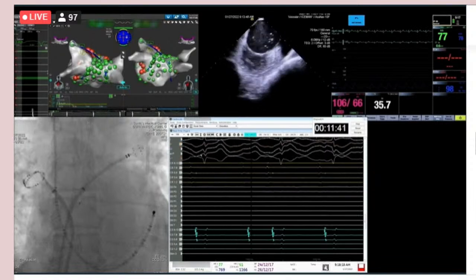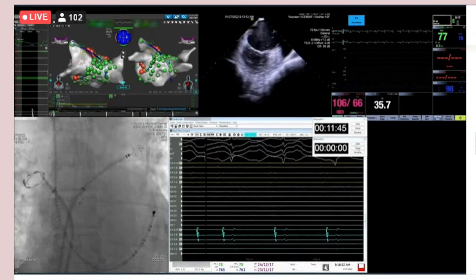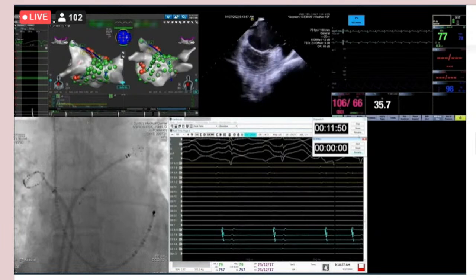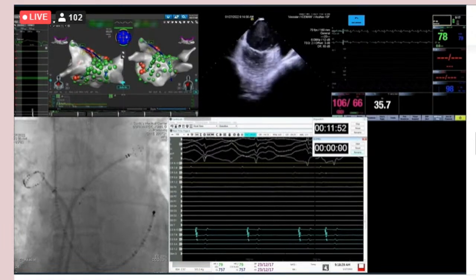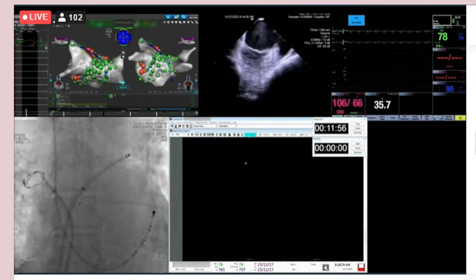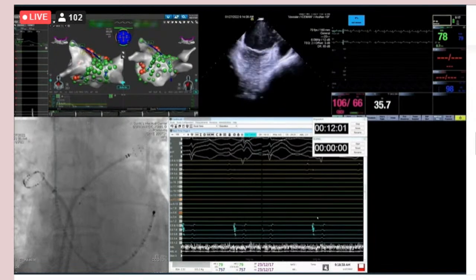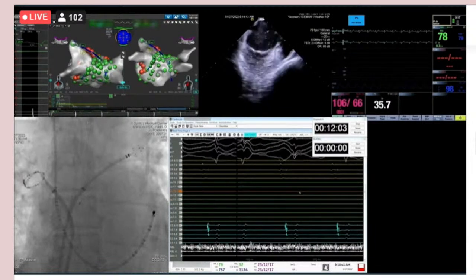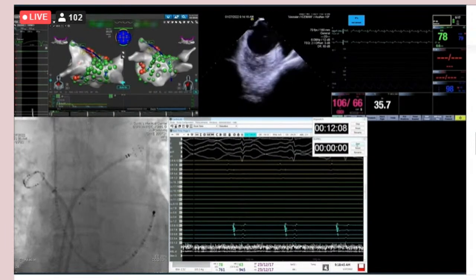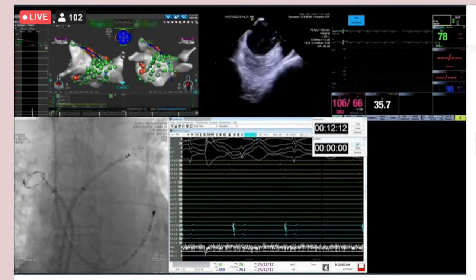So going back to the RF versus PFA, I guess I don't understand. If PFA is so good and great, why would you ever want to go back to RF? Well, I think there's a good reason they did it. If you remember the history of this company, this is not their first version of this. And their first version, and there's different mixtures of trying to figure out what is the precise recipe for the best electroporation, their first outing did not go particularly well.